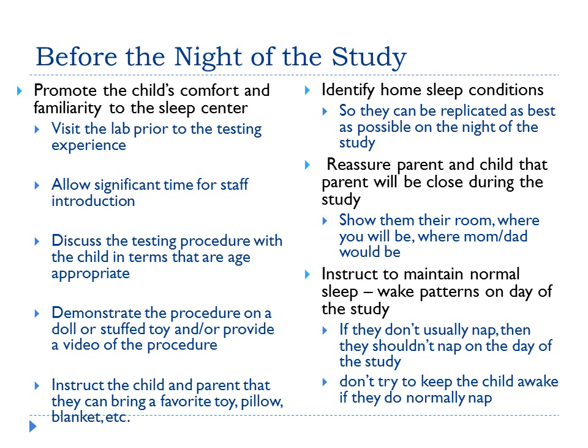Before your night of study for the pediatric test, there's some things you want to do to prepare. First of all, it's important that we promote the child's comfort and familiarity to the sleep center. So maybe they can set up a visit to the lab prior to their test night, allow time for the staff to introduce themselves, preferably have the tech there that's going to be performing the study, and let them discuss the testing procedure with the child in terms that the child is going to understand. Make a game out of it, make it play, make it fun. Maybe you're going to demonstrate parts of the procedure on a doll or a stuffed toy, or maybe provide a video with some animation of the procedure.